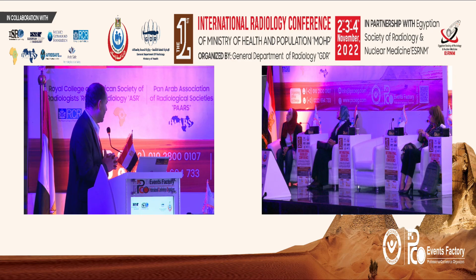But honestly speaking, it is not suitable for adults, especially in the state where I work, morbid obesity is a problem there, so good luck with ultrasound in this patient, really good luck. If you put the probe there, you will see nothing. But it's really good for pediatric populations. Yes, I would definitely try ultrasound with young patients, pediatrics and young patients, especially if they are thin, slim, those patients, definitely ultrasound will be great for them. But otherwise, I will not.